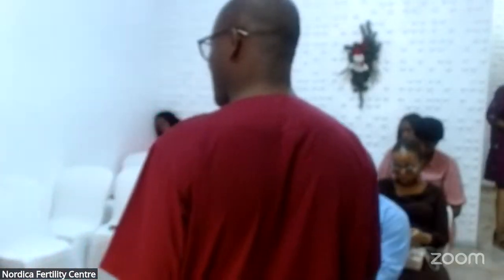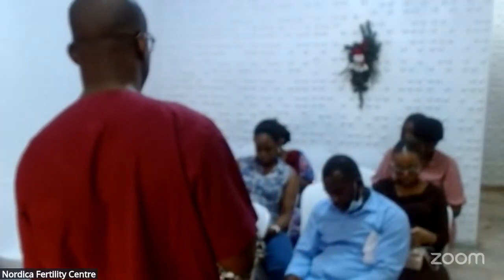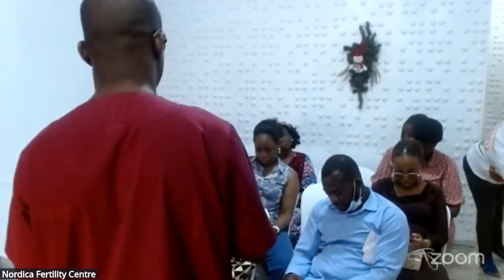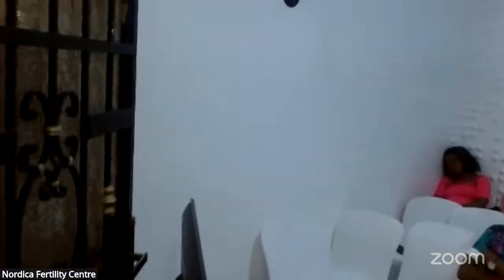Does Hifu affect my fertility? The answer is no. A number of adults have been able to conceive naturally after Hifu treatment, and some who have other issues that make them unable to get pregnant come for assisted reproduction. They've been able to achieve success following Hifu treatment of their fibroids. Can we repeat Hifu? The answer is yes.